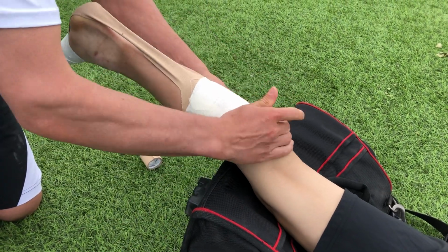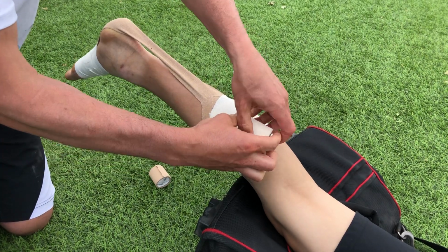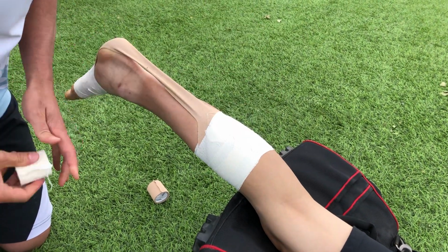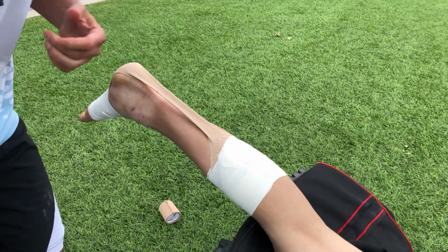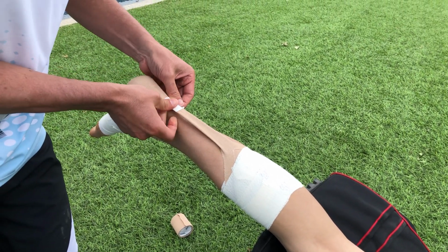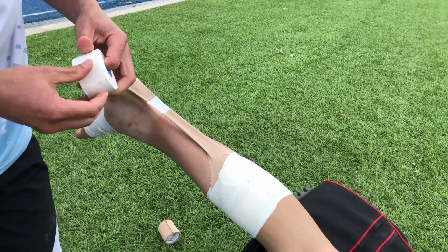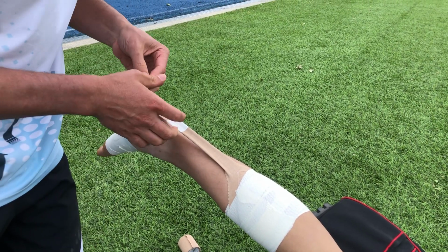Sometimes you might adjust the tension after having done this. You might unwind this layer and readjust your tension if you feel like you didn't quite get it right the first time. We can also secure this so that it won't unravel for him during gameplay or whatever.